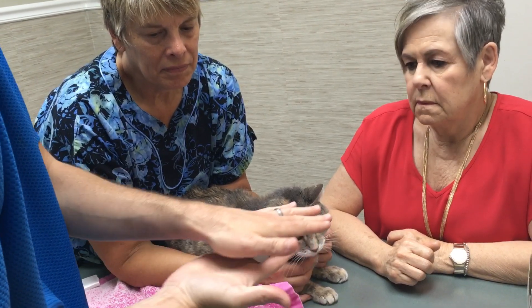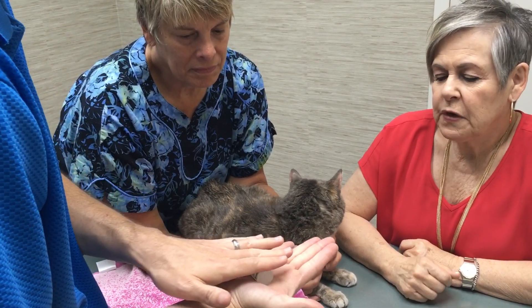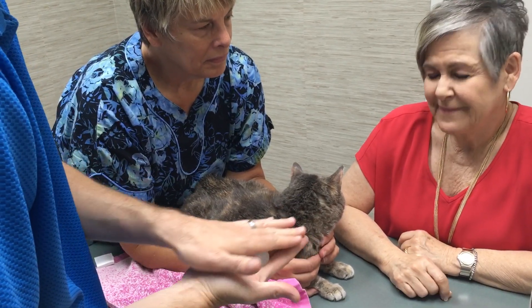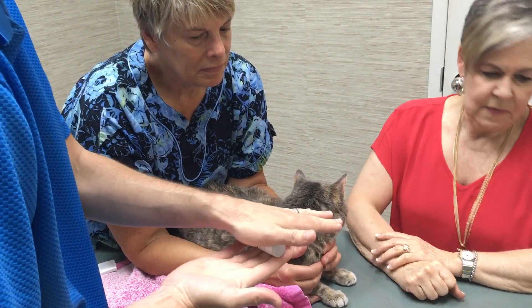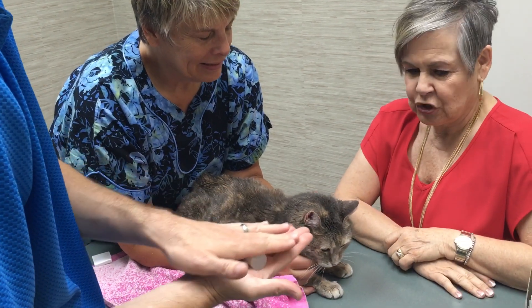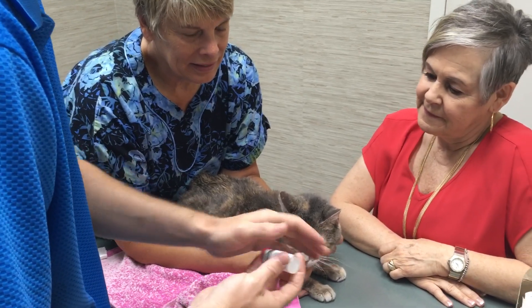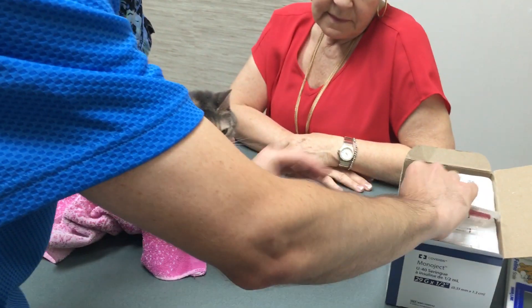Just roll it back and forth. This stays in the fridge whenever you're not using it. So I can't pre-draw it up? You cannot. Okay, I thought I could maybe just draw it up. So we do that and then repeat the process with drawing up one unit. If I give this to her now, it won't matter — then I give it to her again in the morning, you'll be fine. We're going to probably go to two doses per day.